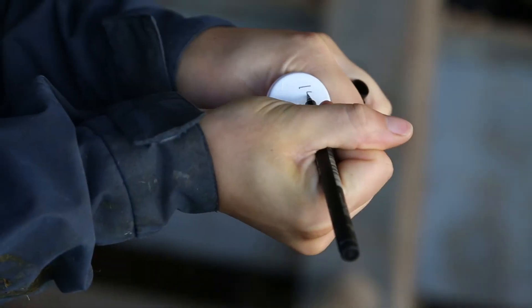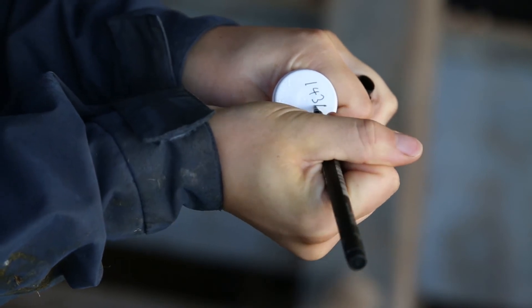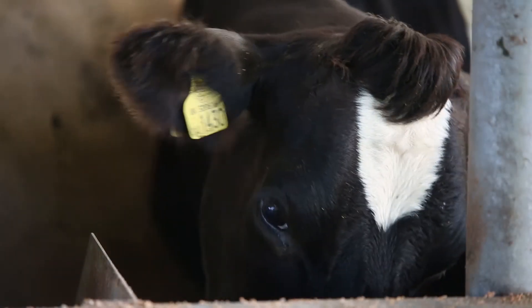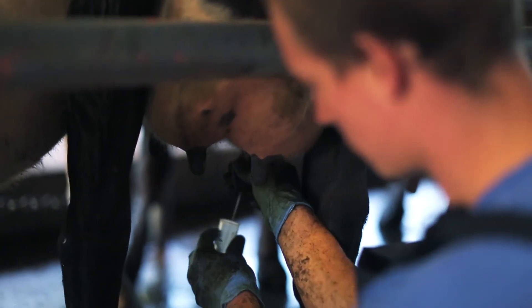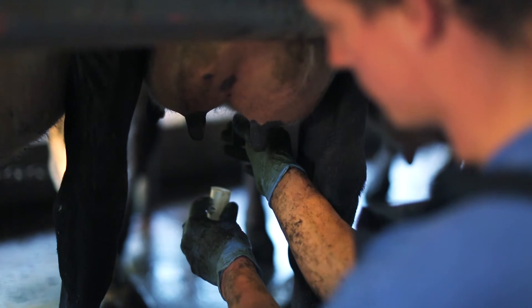Write the number of the cow you're testing on a collection receptacle and check it against her number. Prior to milking, strip the teats three times onto the floor, then collect some milk in the receptacle.